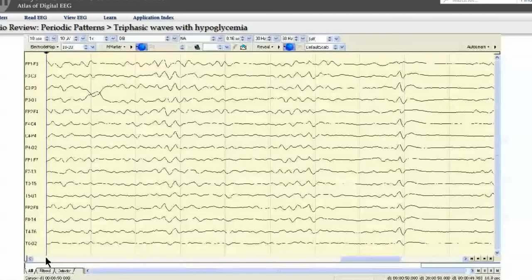In summary, this EEG shows a typical pattern of severe diffuse encephalopathy. It is viewed as representing both subcortical and cortical dysfunction. This pattern is not etiology specific and can be due to a number of causes such as anoxia, hypoglycemia, and toxemia. Nonetheless, it helps the clinician differentiate epileptic causes of diminished levels of consciousness, metabolic causes, and even occasionally psychogenic unresponsiveness.